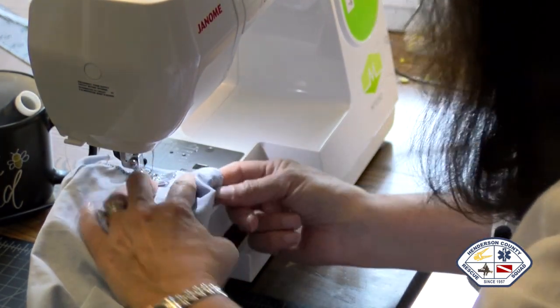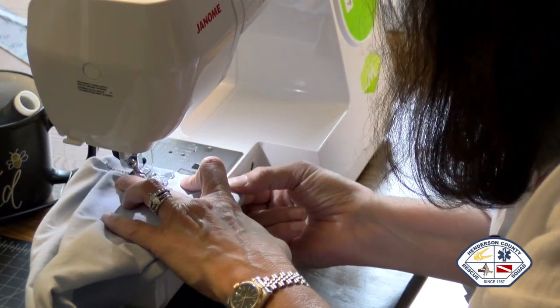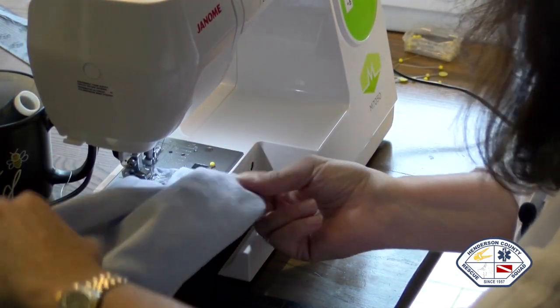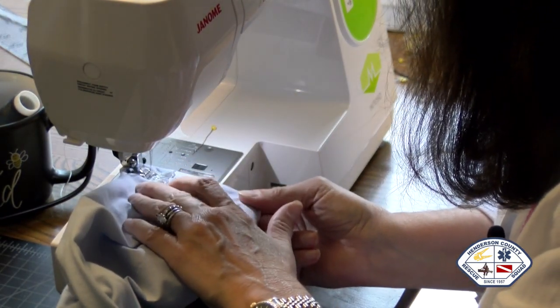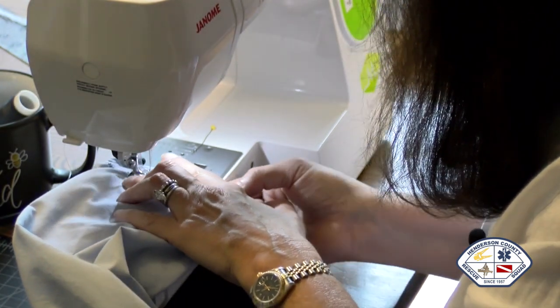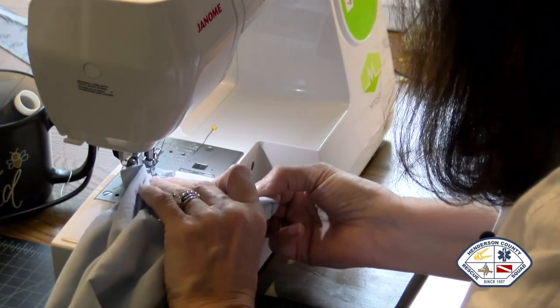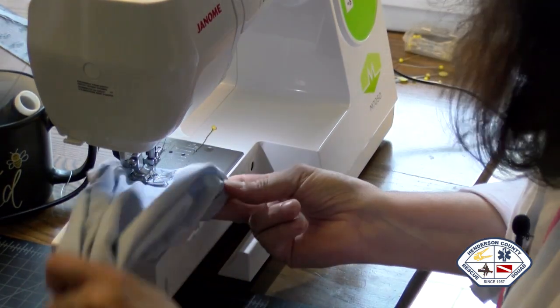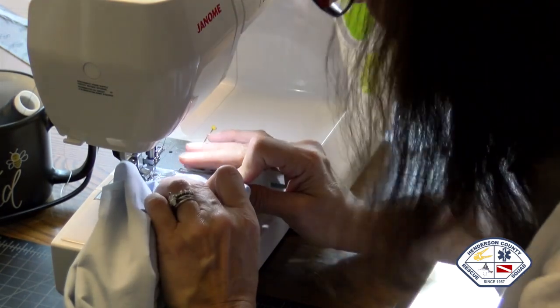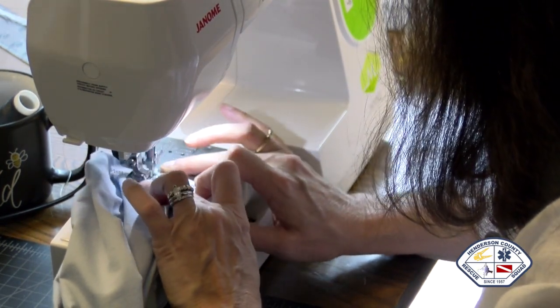Zigzag your edges. We're turning that hem under on the back side. Now, you might have a little bit of excess fabric because it was a little bit wider where we turned it under. If you want, you could make a casing and run some elastic through it, because that's essentially what we're doing, is making the casing. And if you run elastic through it, then that's just a little bit better way for it to stay on the wrist. And if it cinches up a little bit, then you won't see any of this extra fabric, because we're getting ready to cover up. There we go. We're just kind of sewing gathers into it.